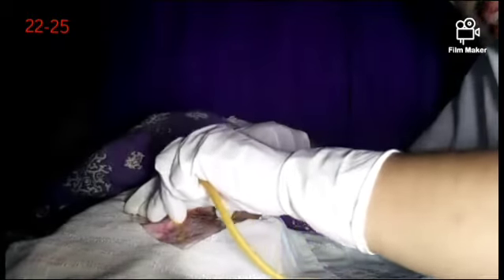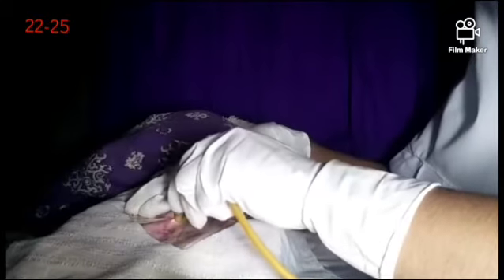Insert the tip of the catheter into the dimple-like structure below the clitoris, which is the meatus, about 2 to 3 inches, until urine flows. Do not force the catheter through the urethra, and instruct the client to breathe deeply and rotate the catheter gently if slight resistance is met. The rationale for this is the sphincter relaxes and the catheter can enter the bladder easily when the client relaxes.